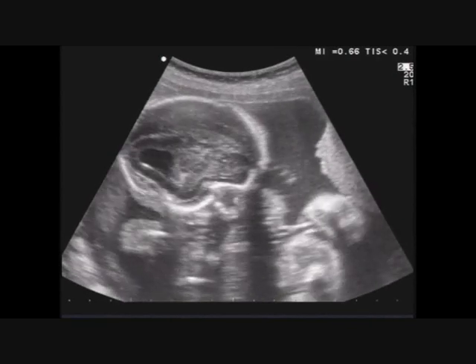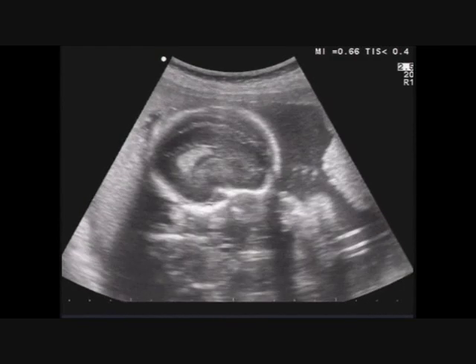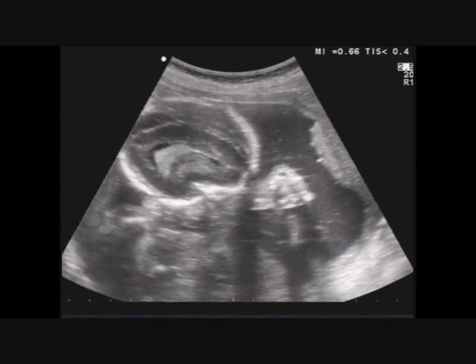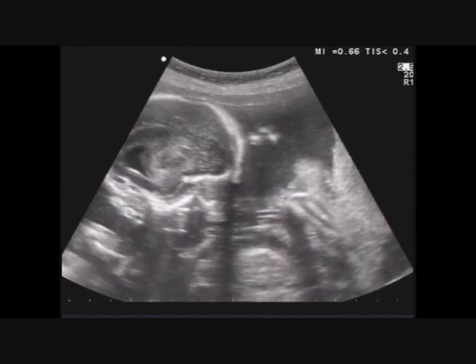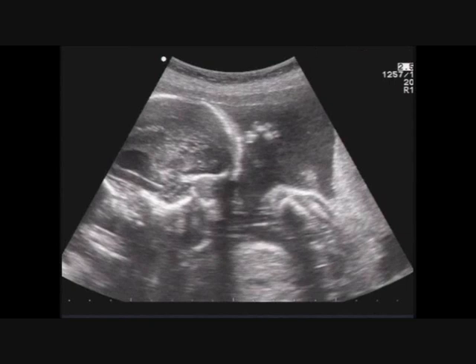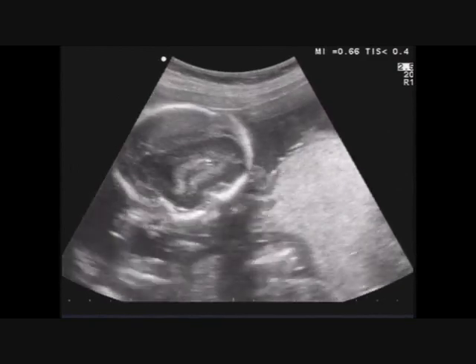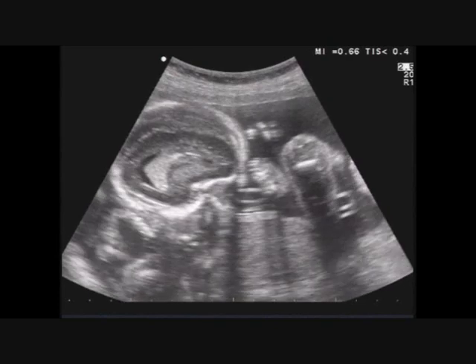And now I show you what you need to do many times. You need to do the median, sagittal section, to see the corpus callosum, that is a classical image of a hook that you usually see in your daily ultrasound examination and that you can see in this specific case. When you don't see the corpus callosum, you aren't sure and you need to be cautious. I show you this image many times, and why? Because you need to repeat this scan many times before being sure that you don't see the corpus callosum.